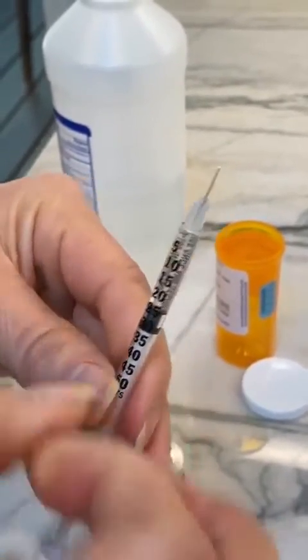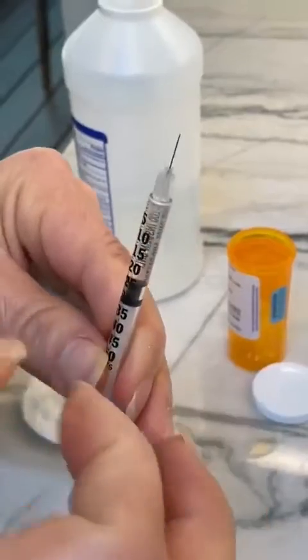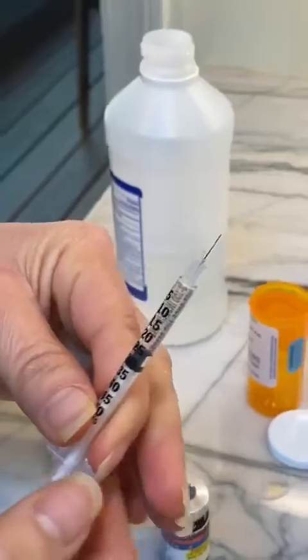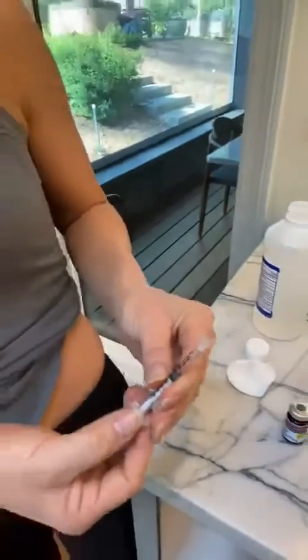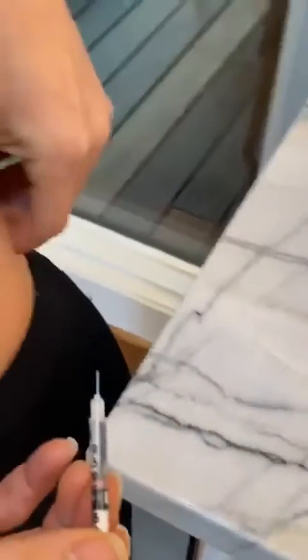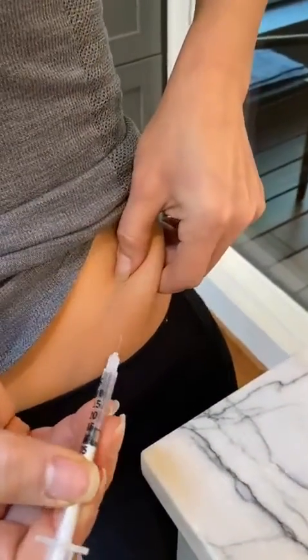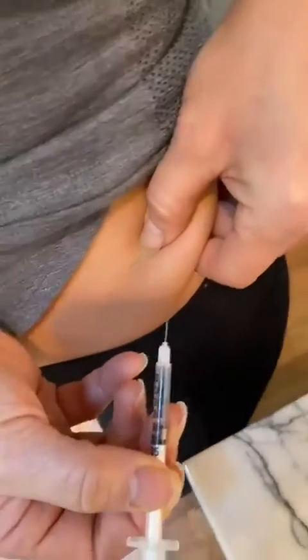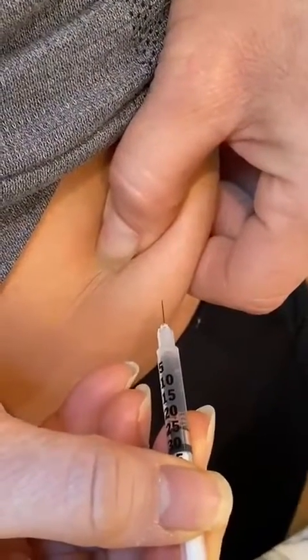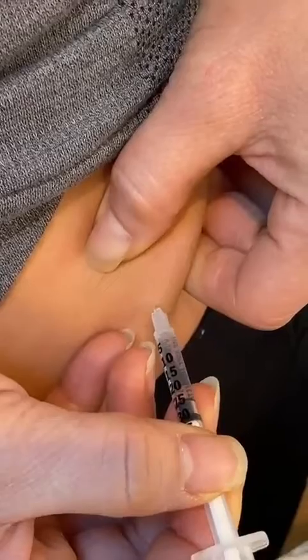Then we'll go ahead and flick it, and as we do that, that will take a little bit of the air out. As we go into this area, bevel up again — there's a little bevel — we're going to grab that area. We're going to have bevel up and inject really quickly at 45 degrees or 90 degrees, quickly, not uncomfortable.